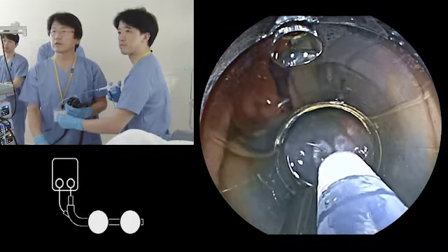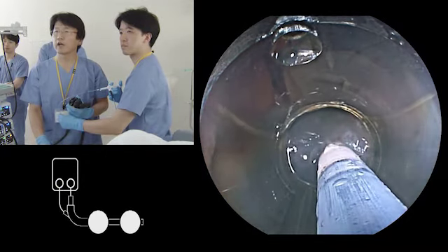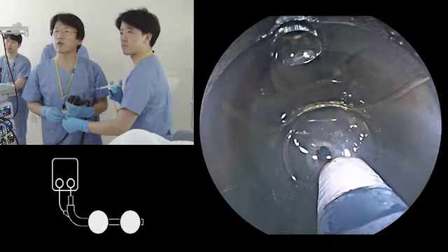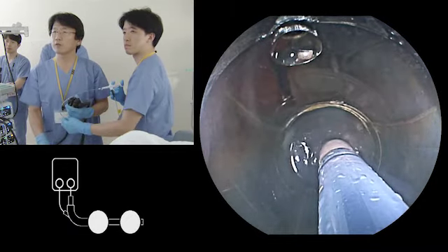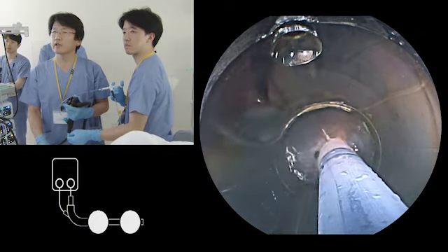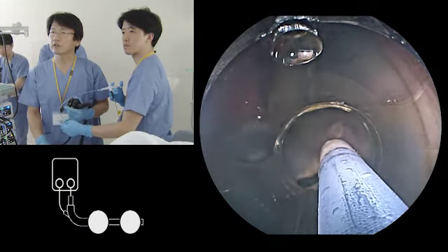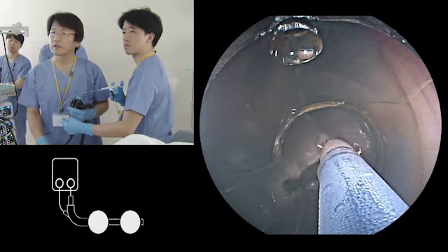So first of all, you make a hole with the ball tip, and the tip of the ball, the flash knife ball, is hooked in the submucosal layer, then move like this, slowly.